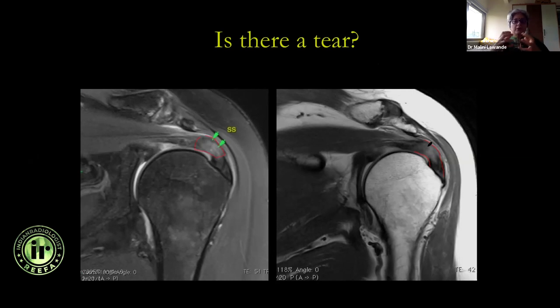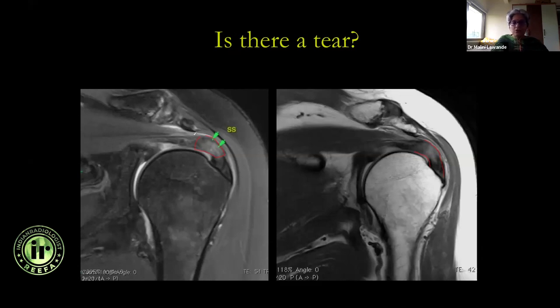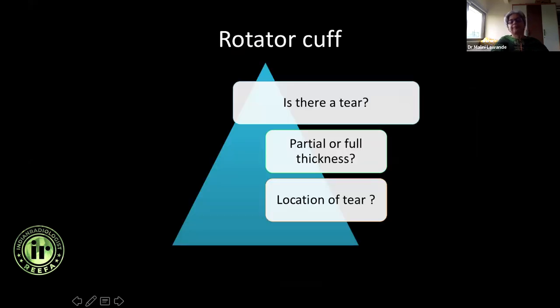This is important because when there is severe tendinosis, the internal fibers are not tightly packed together — hydrogen protons are moving and giving bright signal. Sometimes these can be as symptomatic as a full thickness tear because the tendon is not really functional, and the surgeon may decide what to do based on that. But it's not a tear right now because there is no fluid signal intensity. So this is severe tendinosis.